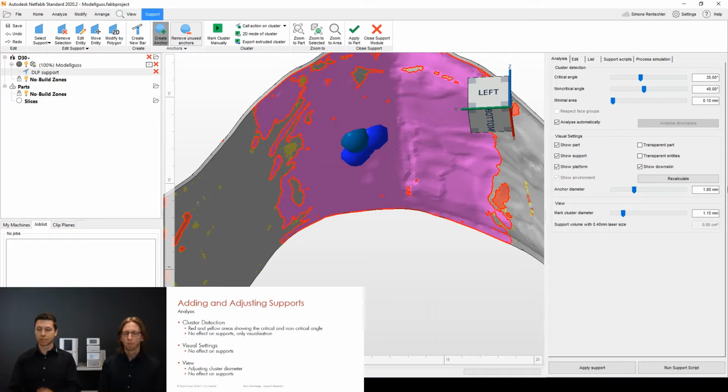It's just important you know how to reduce the anchor diameter in order to see, for example, the connection point and the breaking point of the support itself if you're designing the support on your own. So we will set this back to 0 just for later on, and I will remove all anchors and entities. Robert will explain to you later. Yes, so, we will come to that.